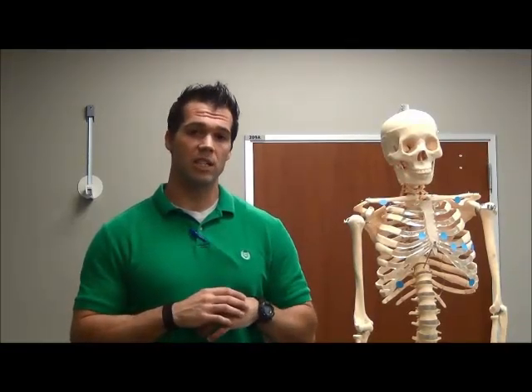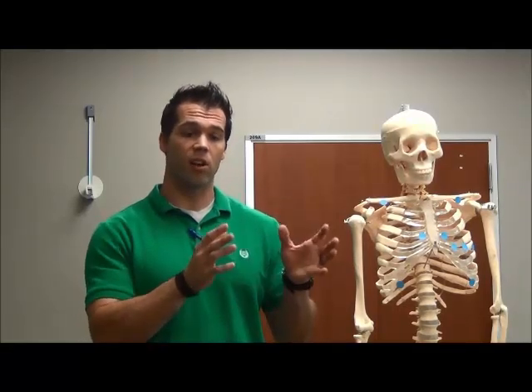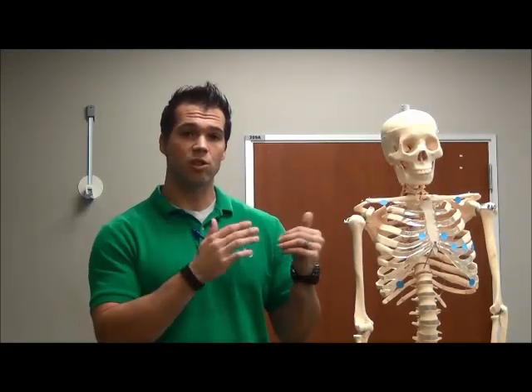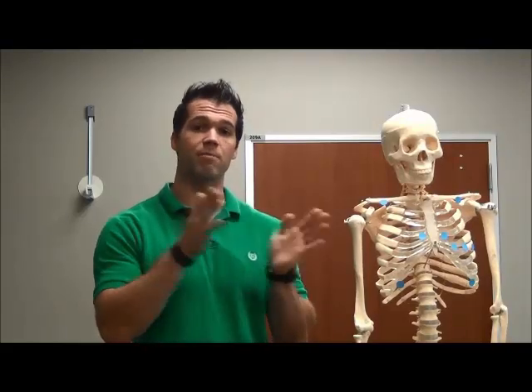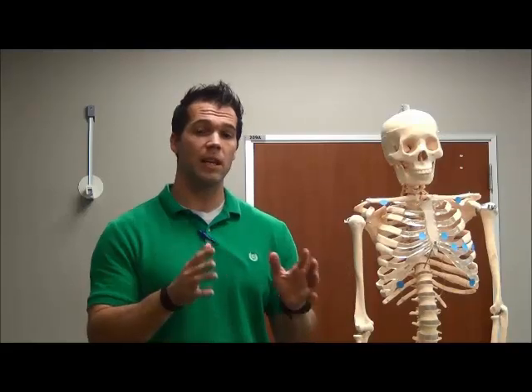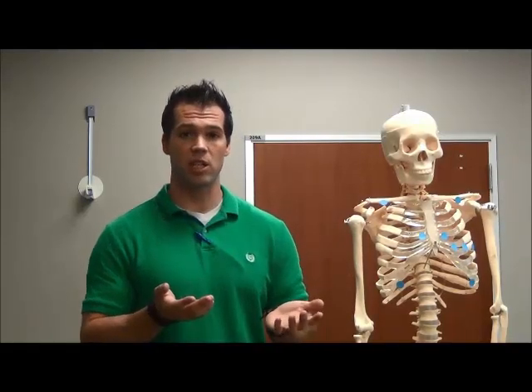What an ECG is, it's measuring the electrical activity of the heart. The heart is pumping and contracting based off of electrical currents. Those currents should be functioning within the proper time frames. And if they're not, then something is going on with the heart. Today we're just going to talk about how to prep a client to have their ECG measured.